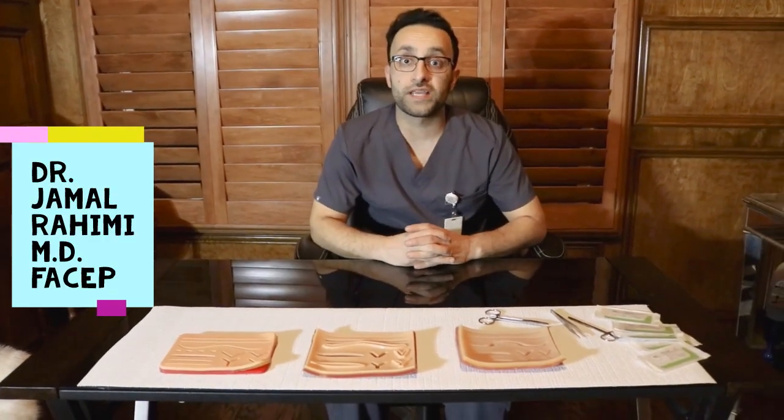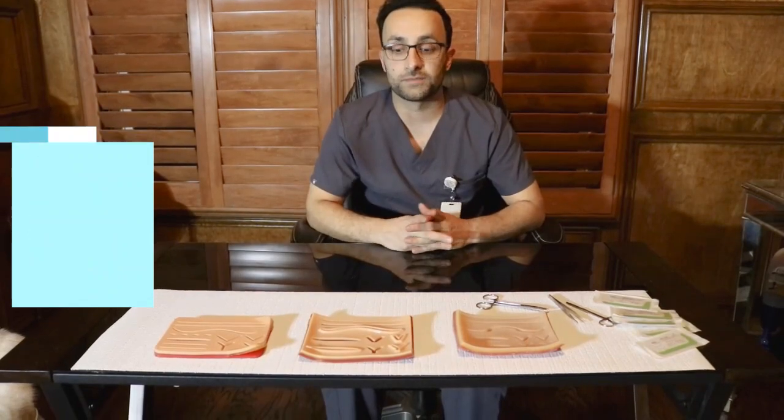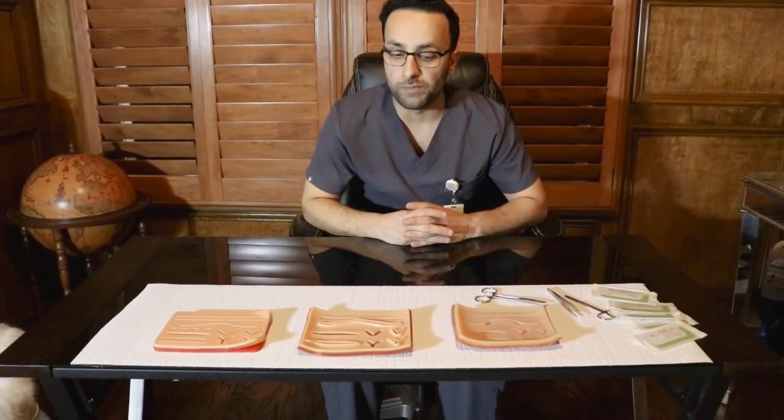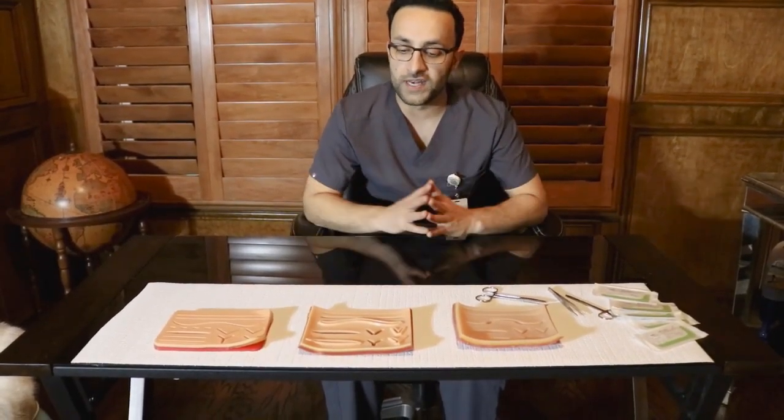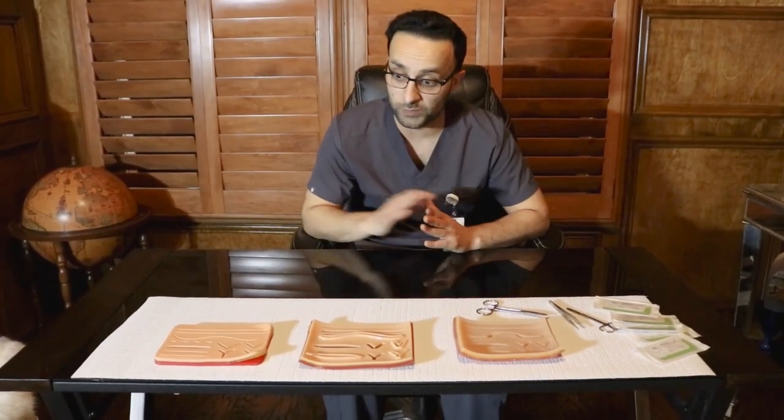Hi, my name is Dr. Jamal Rahimi and I'm working with my friends at SutureBuddy. Today we're going to talk about some different types of suture pads. We purchased a couple of different ones on the internet and we're comparing them to the SutureBuddy suture pad, so let's talk a little bit about each one.